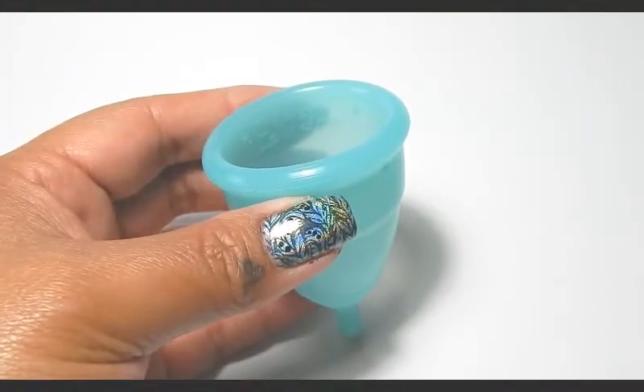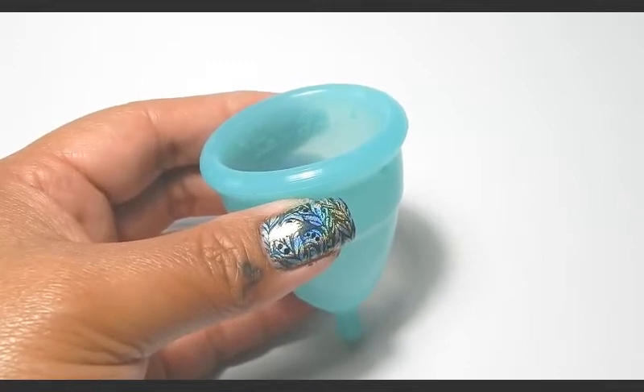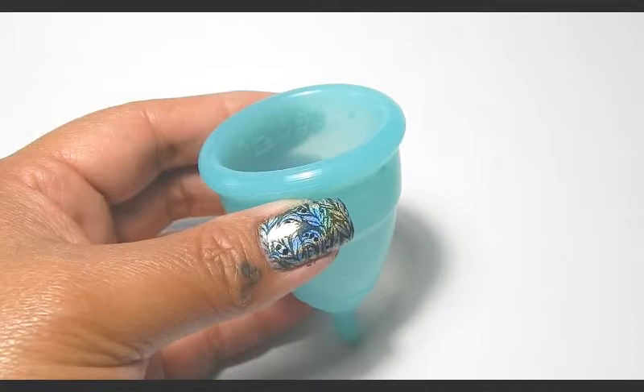The labia fold can be a little tricky, but a lot of people like this fold for cups that are harder to get open.